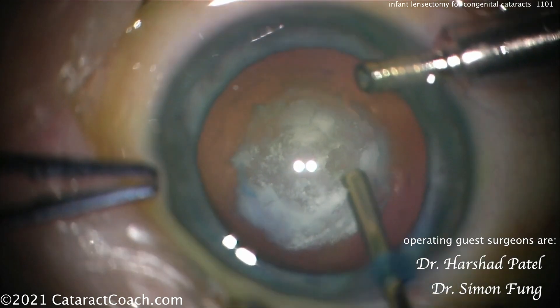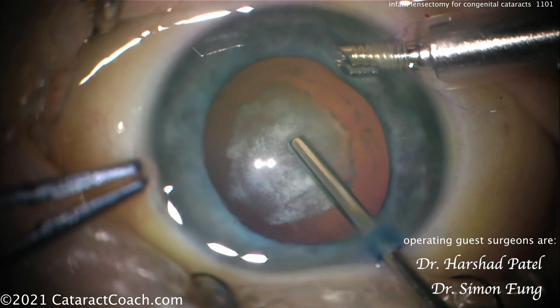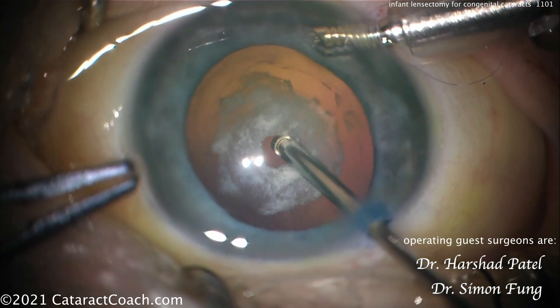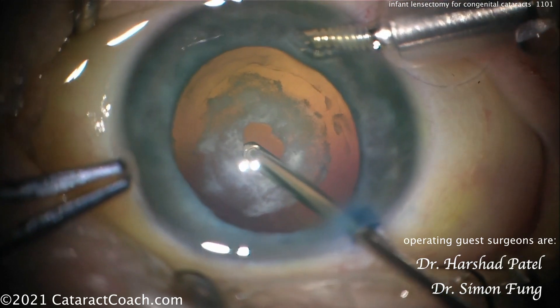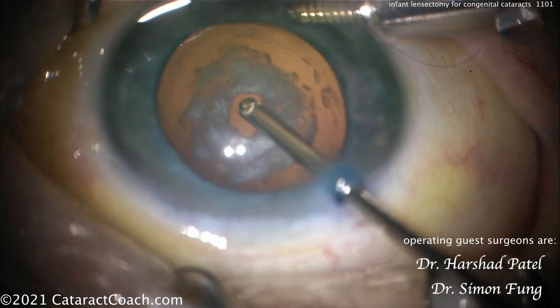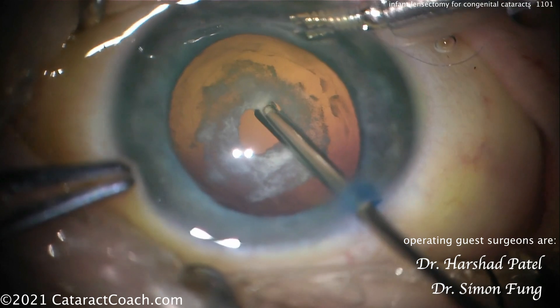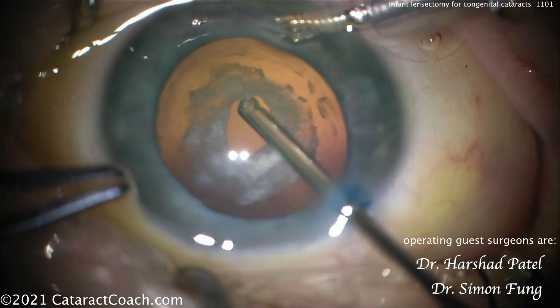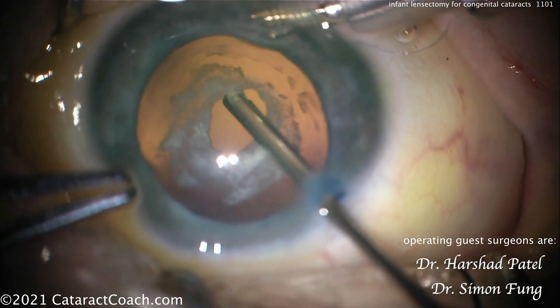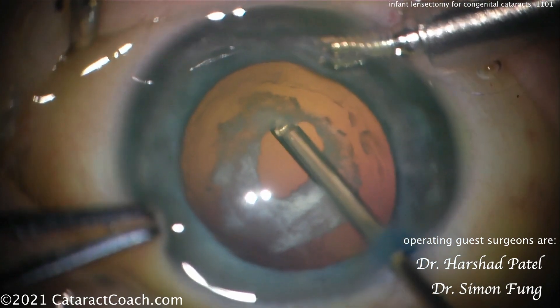Make sure you keep in touch with the anesthesiologist to say how much more time you're anticipating for your case. Especially with small patients that are under 10 pounds, we have to be very careful with anesthesia and systemic issues. Now getting in through it — I'm going to open up that posterior capsule as well. Nice technique. You can also try a little bit lower cutting speed, which can be very helpful. Remember, the lens material is very pro-inflammatory, so you want to really clean it up. Some of this was scarring on that posterior capsule, so that's being opened up beautifully.